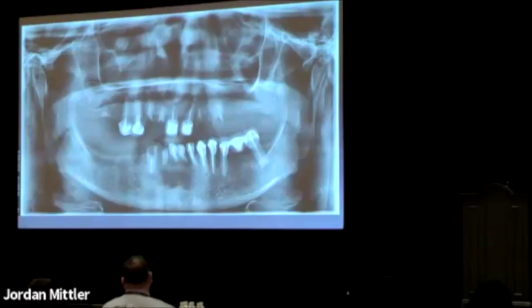You've got infection areas on almost all of them. You know, it just didn't seem appropriate. And this is the situation where you really just have to go to immediate dentures. Didn't want to, but it's almost unavoidable in this case. You could place implants and do it, but I don't think you'd end up with a great result if you did.